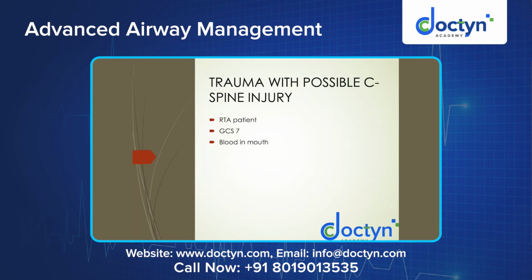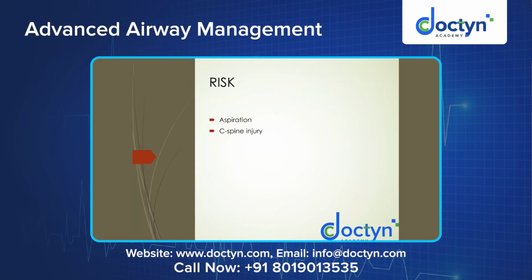The same again, a road traffic accident patient, when there is a suspicion of C-spine injury, the GCS is 7. There are too many bloody secretions in the mouth. As we said, the risk of C-spine injury is there and risk of aspiration is there. That's why you decide to intubate, but you have to give jaw thrust, avoid chin lift and head tilt, inline stabilization, avoiding movement at the cervical spine, rapid sequence induction, protect the spine, protect the airway.